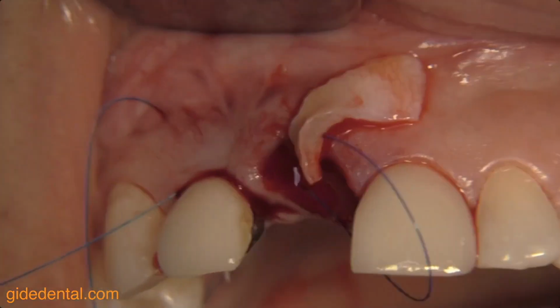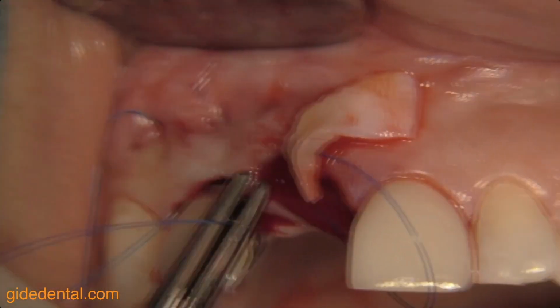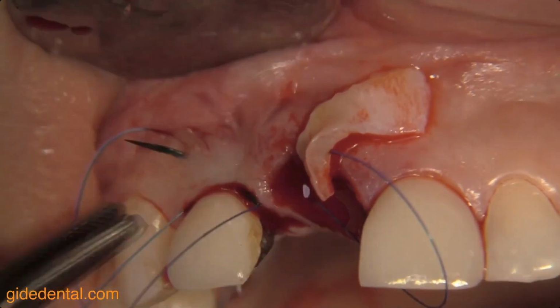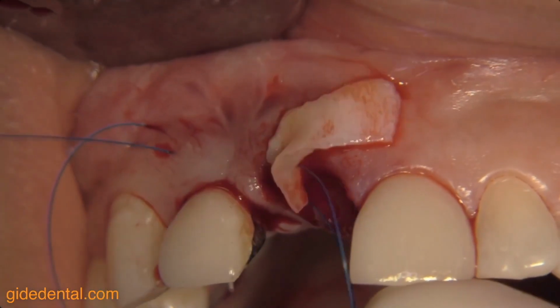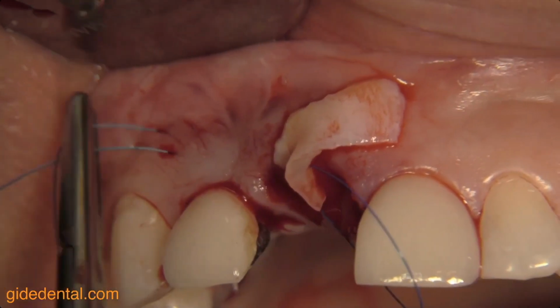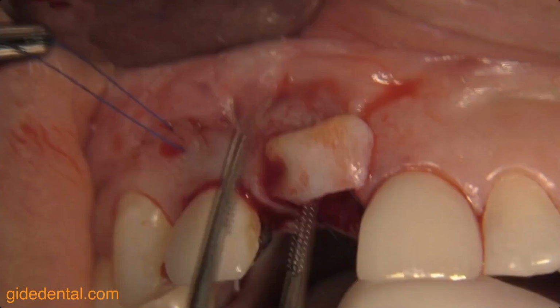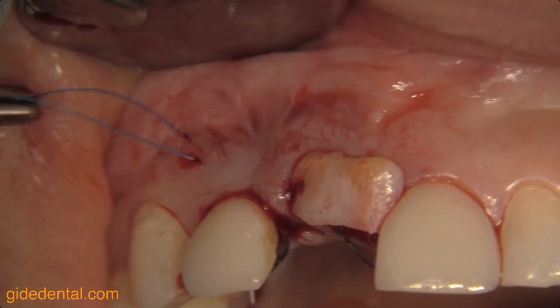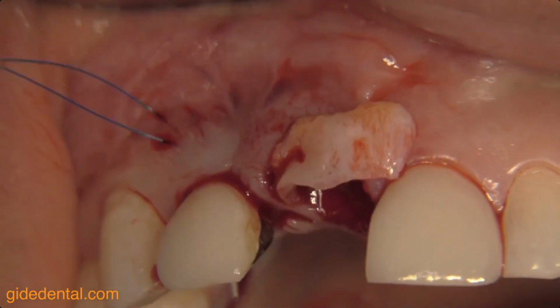Then I go through the sulcus. Again, I will exit in the apical space. So it depends a little bit on where I want the soft tissue graft to go. So remember, this is a sling suture, and it's going to be pulling the soft tissue graft in. Now notice what's going to happen. I'm grabbing the suture with the plier, and gently I'm pulling the connective tissue graft into the space. So let's see if this will happen.